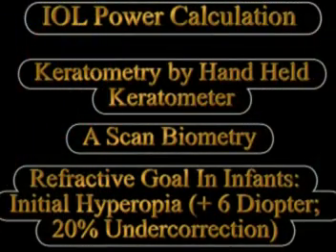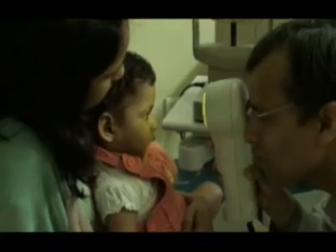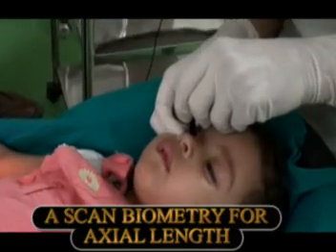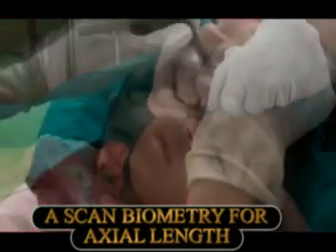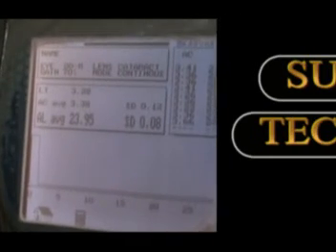For the IOL power calculation, a handheld keratometer is necessary for these small children. Cooperative children may allow handheld keratometry to be performed without anesthesia, but some of these children may not be that cooperative and keratometry may be performed under EUA. An A-scan measurement is done for the axial length, and then the IOL power is calculated and the intended power according to the age is found out.